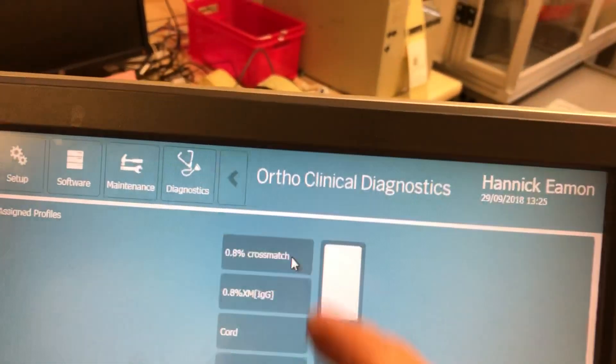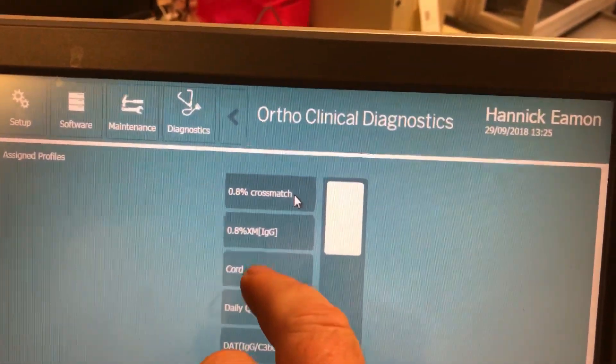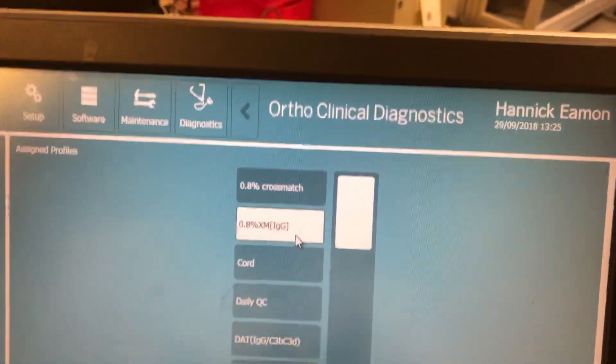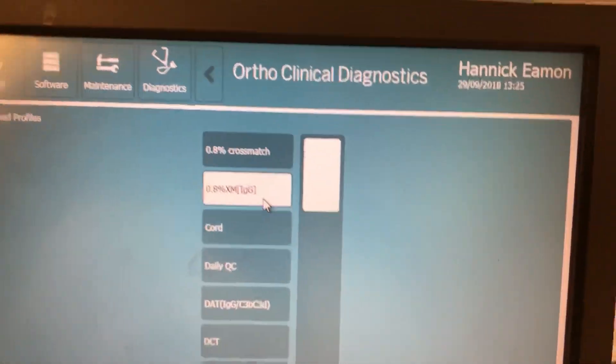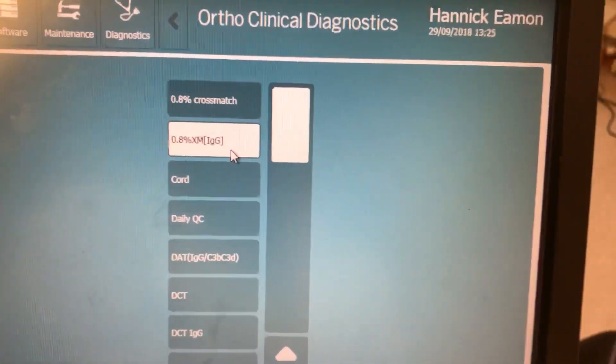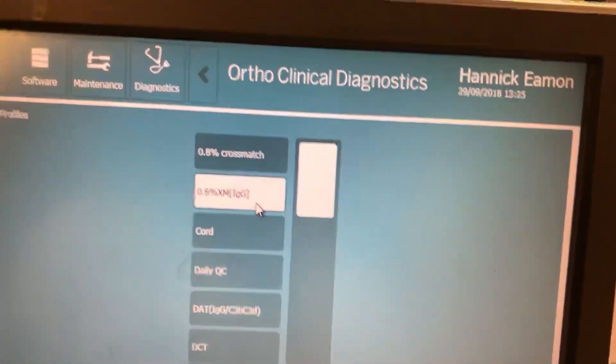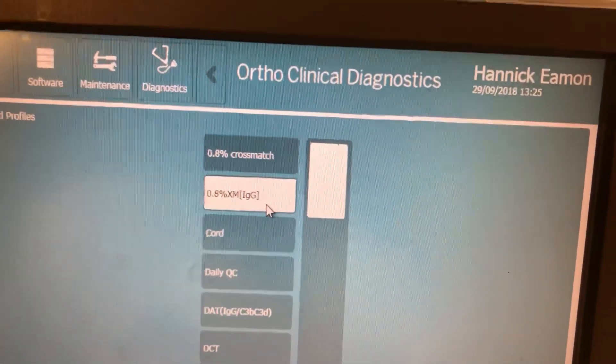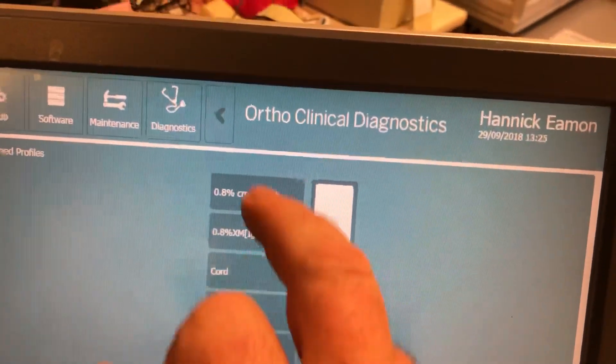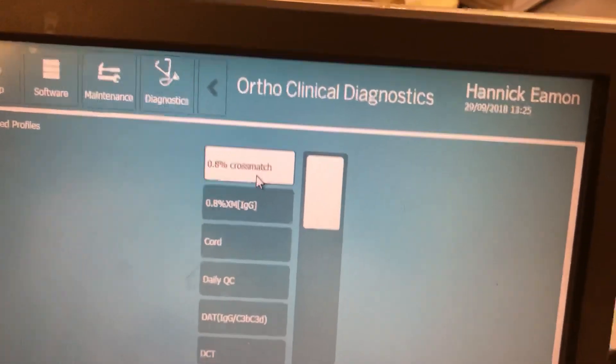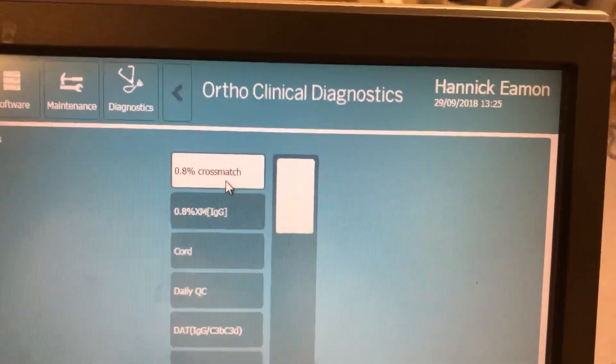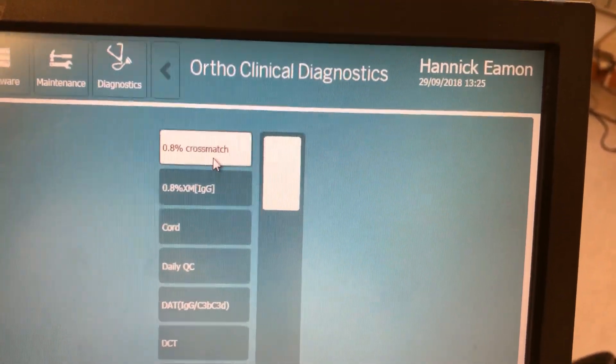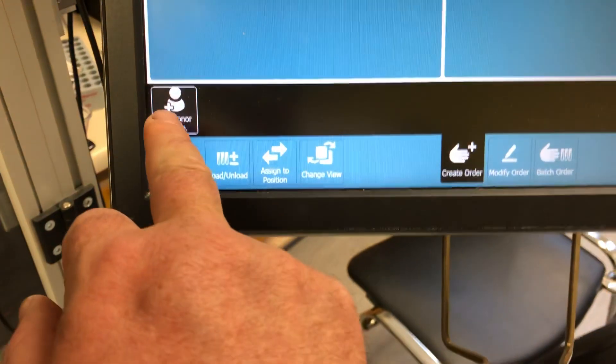Now you'll notice underneath it I also have the option of a 0.8% cross match with IgG. And this is handy to use in the case where you suspect a patient has an auto antibody. It will just set it up on the IgG only card. But in this circumstances for the purpose of this demonstration we're going to use the 0.8% cross match.